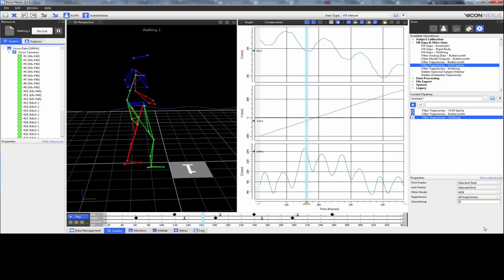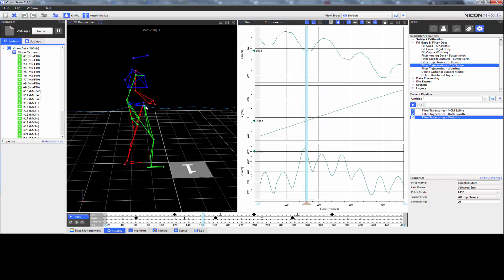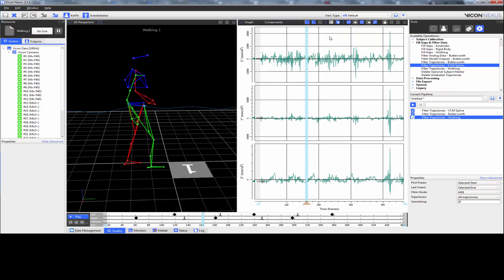To see whether the filter has been applied or not, we select a marker. In this case, I've selected the right ASI marker. We can see here that the position data of the components looks relatively smooth. However, if we change the view to the acceleration, we can see that there is a lot of noise over here.